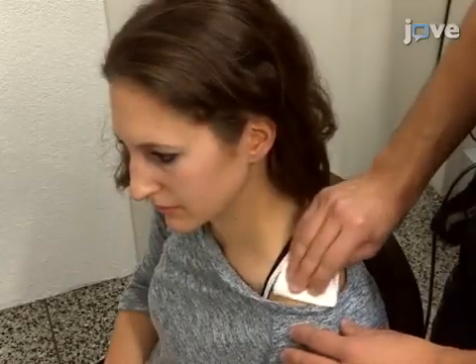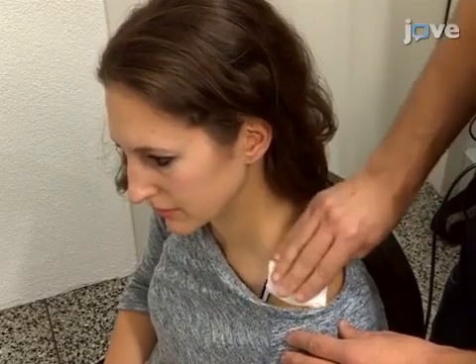Begin by preparing the skin of the shoulder for the TACS electrode by using a gauze pad and an abrasive skin gel.